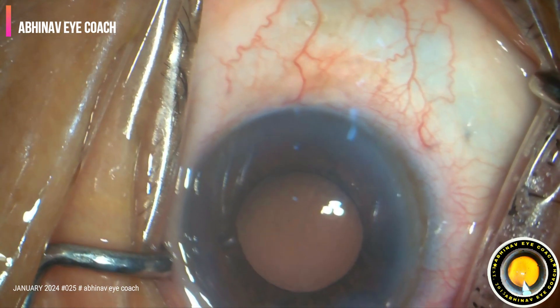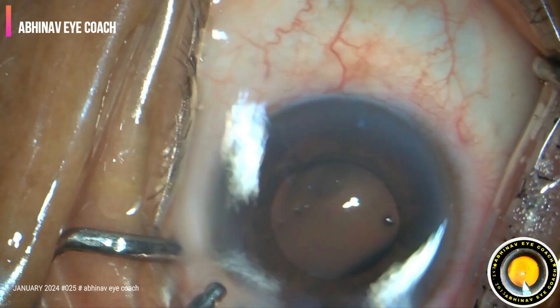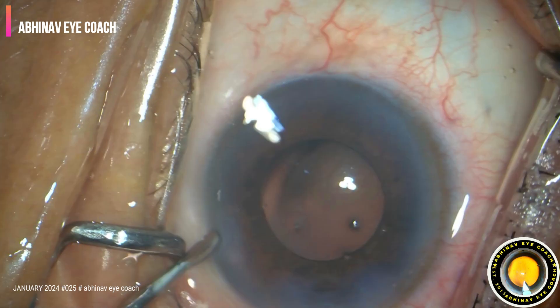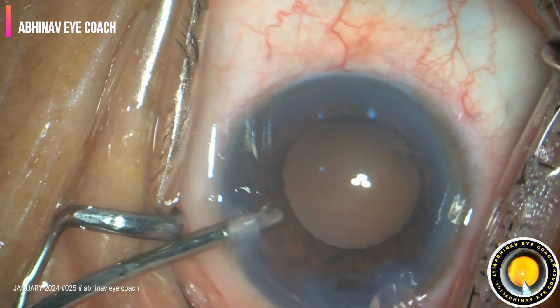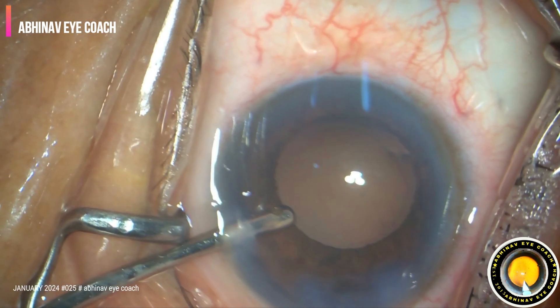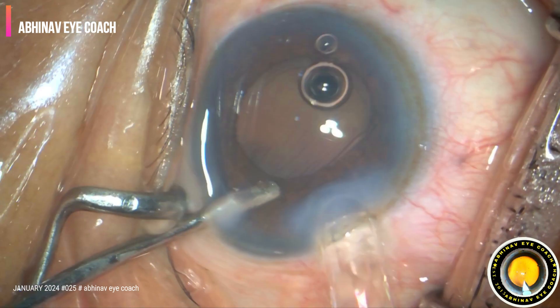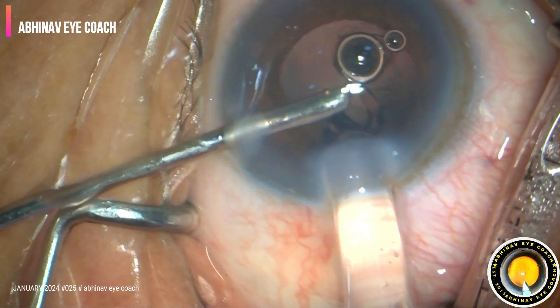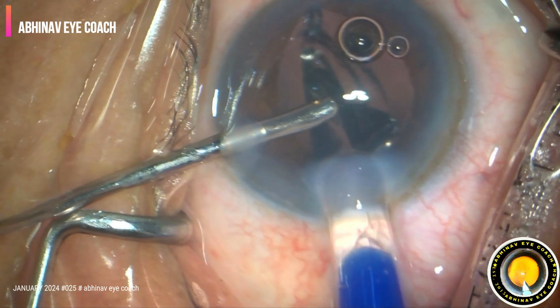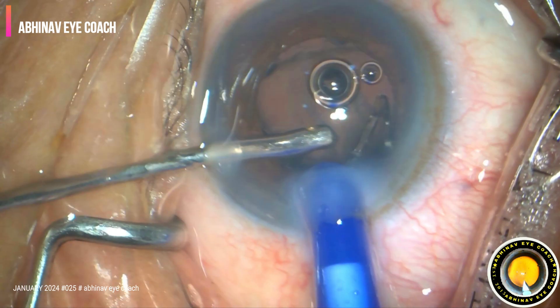The lens is loaded. The eye is filled. Here, I am going to do the hydro implantation of the IOL. This is the irrigation port of bi-manual I/A — irrigation aspiration. One piece acrylic lens is implanted.